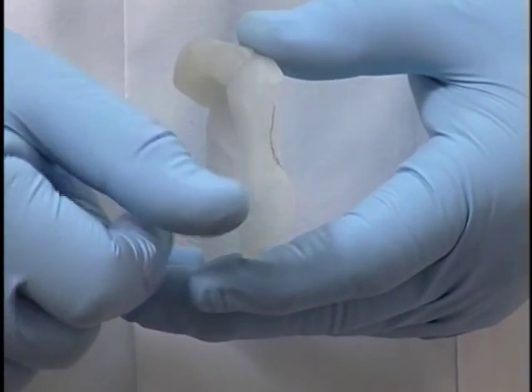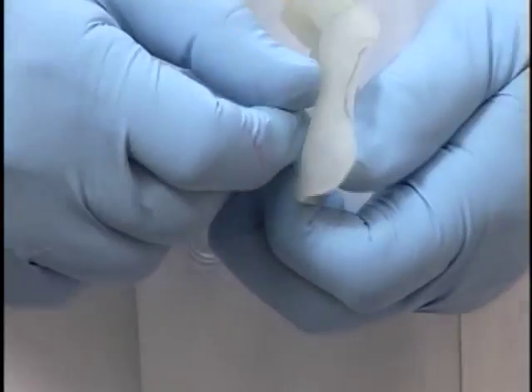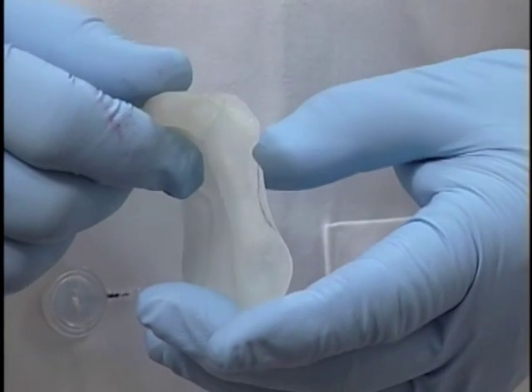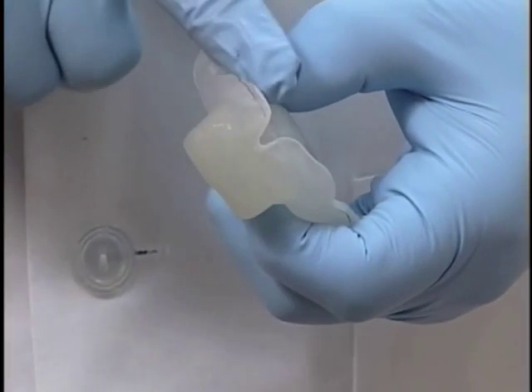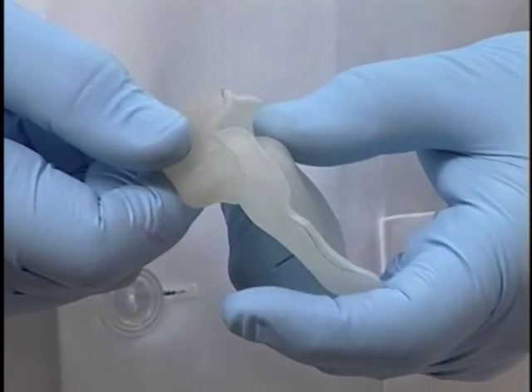I've marked on the tray areas that were overextended, and you can see it marked here in the left zygomatic arch buccal frenum area and a little across the right labial. And now what we need to do is to just trim that off to shorten it down to those marks.